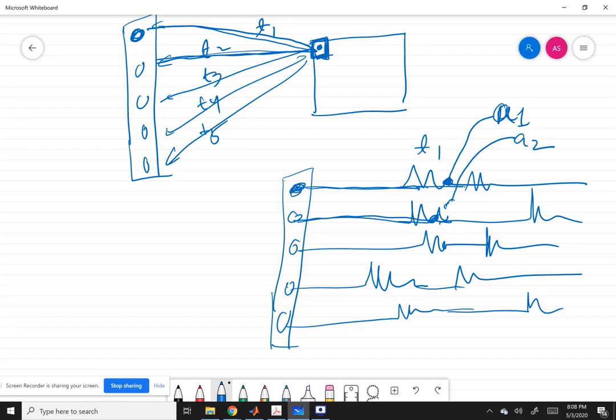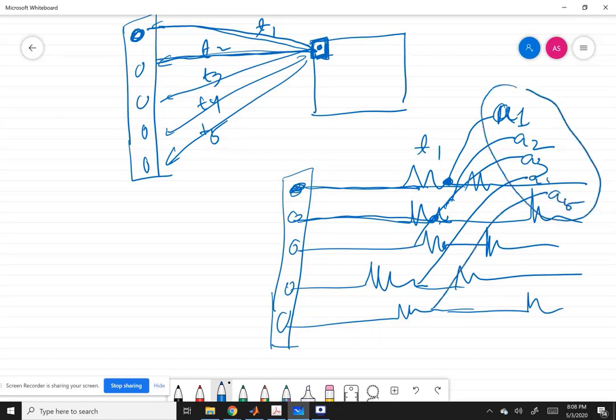Third one, suppose you extracted from time t3 the amplitude a3, then a4, a5. Then these five amplitudes you add. Whatever amplitude you got from the summation, you put that value at this pixel.